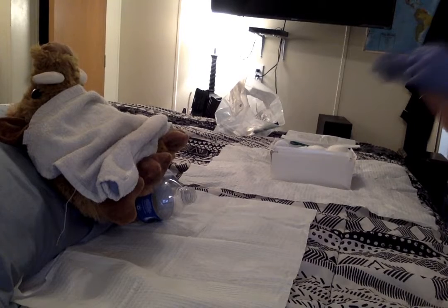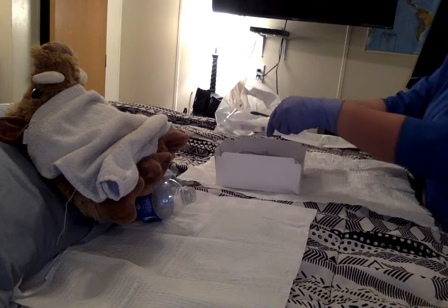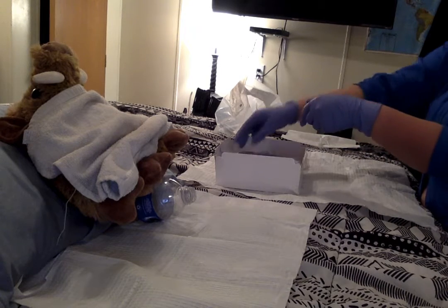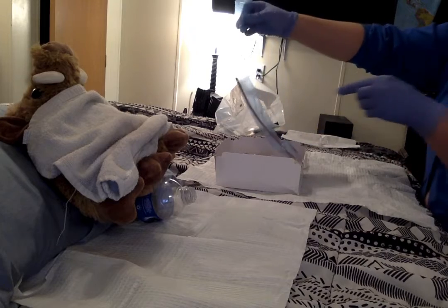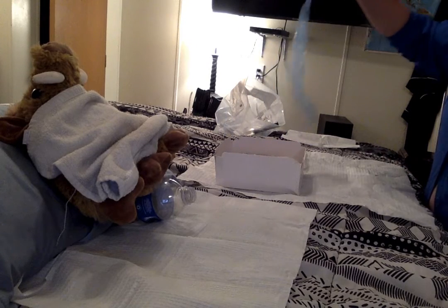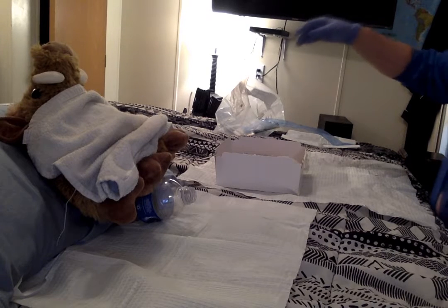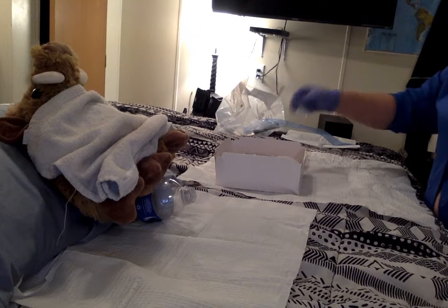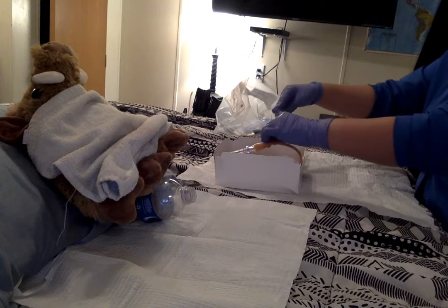Okay, the next thing we're going to do is we're going to scoot this little tray over. We're going to make sure that it's still within the sterile field. And we are going to take off this piece of blue paper off of our urinary catheter. We're going to throw that in the trash. Next thing we're going to do is we are going to grab our 10cc syringe, and we're going to plug it into our urinary catheter.